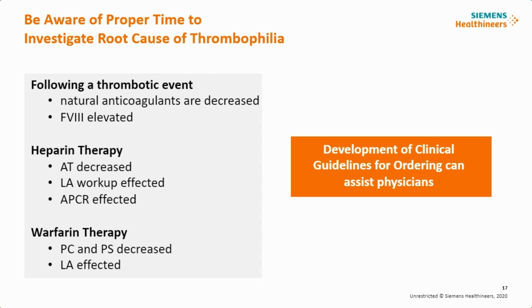Another example is heparin therapy, right? Depending on if the patient has antithrombin that's decreased, you could have depressed results for your heparin. Knowing some of this information, being able to adequately assess it is important. Again, and I'm going to say this multiple times throughout this presentation, but remember, we're all in the same business to ensure good results that improve patient care.